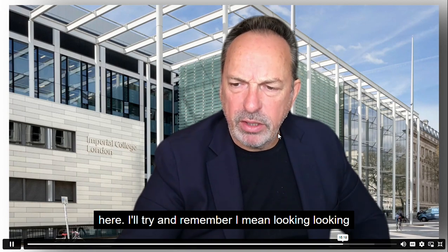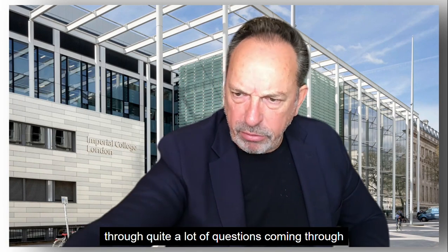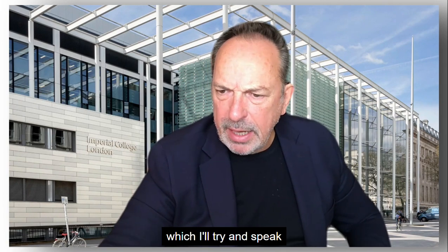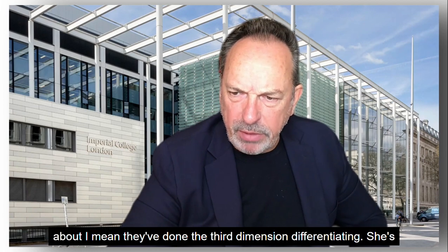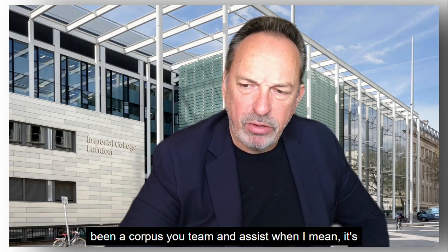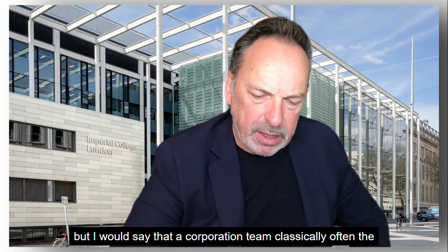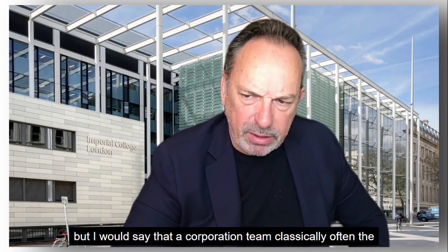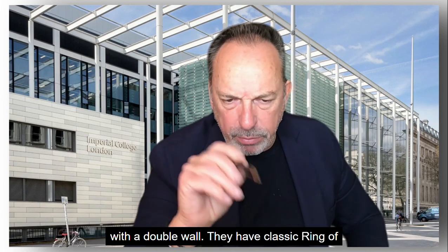There are a few other questions here, which I'll try and remember. Looking through, quite a lot of questions coming through. They've asked about differentiating between a corpus luteum and a cyst. Well, it's not always that simple. A cyst is just a fluid-filled area. But most corpus lutea have a very classic appearance, almost with a double wall.